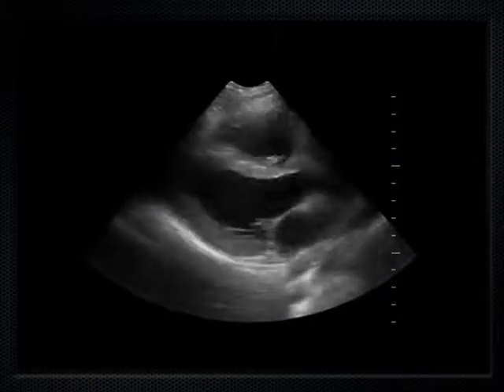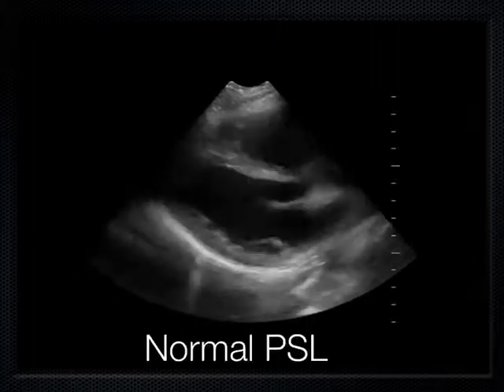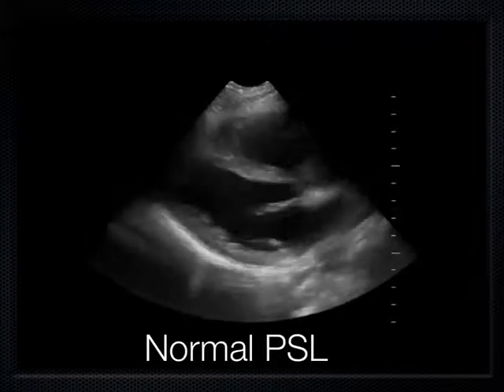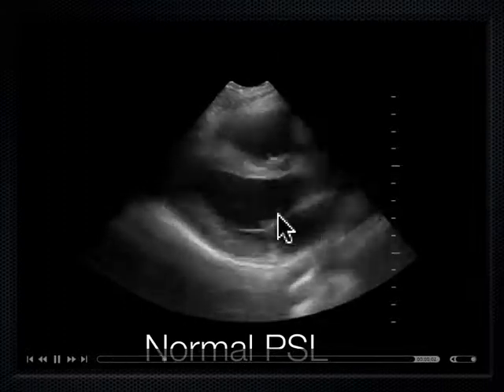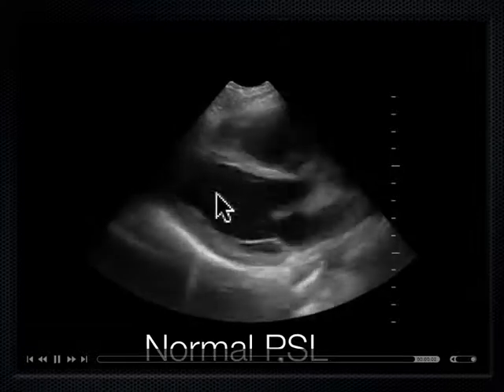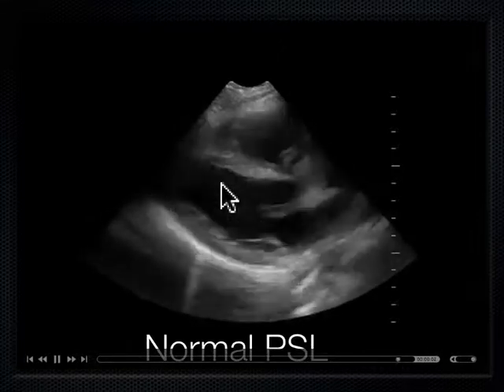And this is what it looks like in all its glory, a nice normal-looking parasternal long axis. And I say normal because when I look at this, I'm looking for really two main things. I'm looking for that this mitral valve comes up and smacks that septum, and number two, that this posterior wall and this interventricular septum make their way towards each other. And indeed, they are doing that in this view.